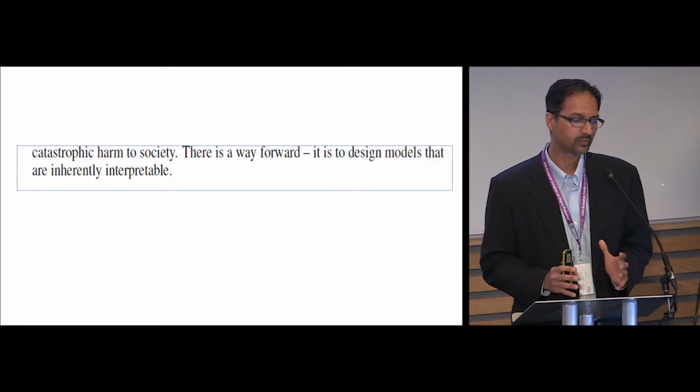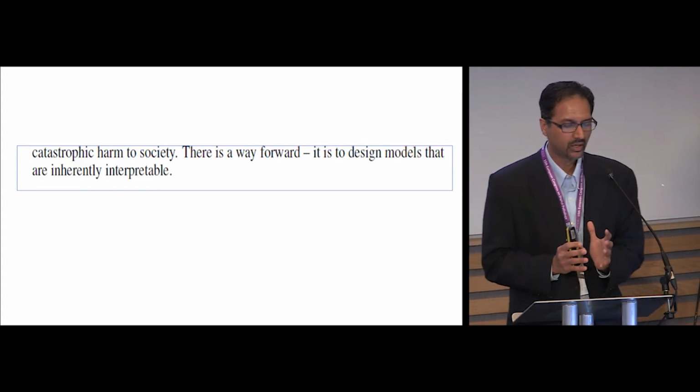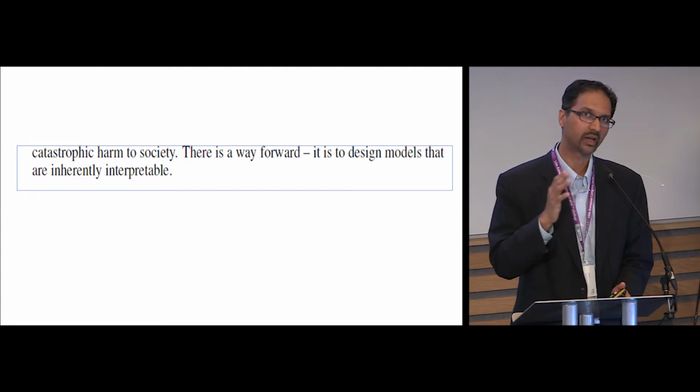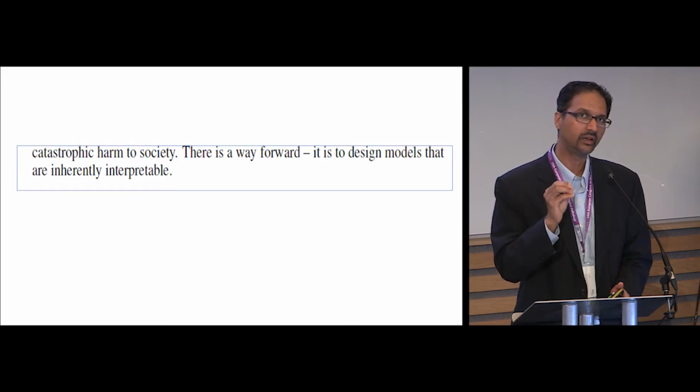I think from the precision medicine, precision diagnostic perspective, it's very important to bear in mind that when you're talking about making decisions on how patients should be treated, should these patients get chemotherapy, should they get immunotherapy, there's a real need to make sure that the models we have are interpretable, right?